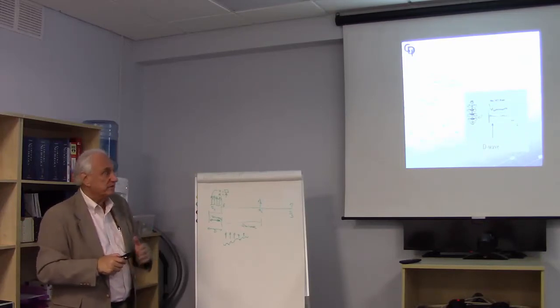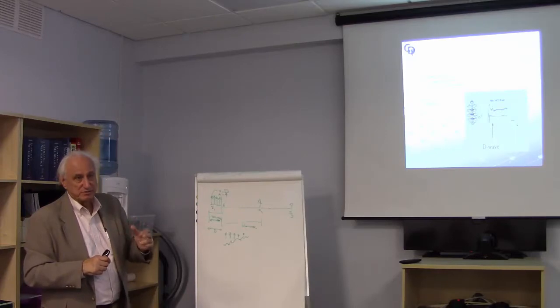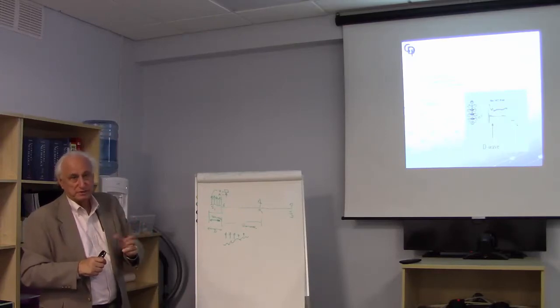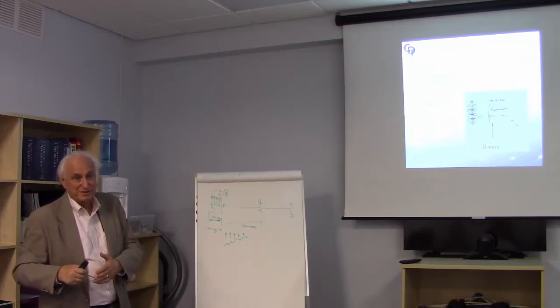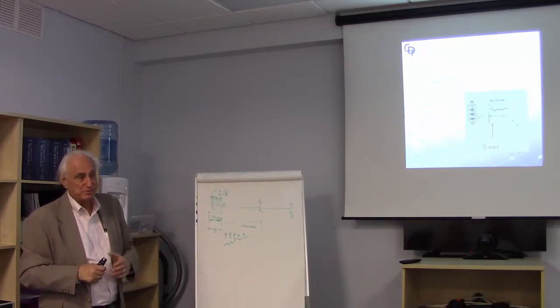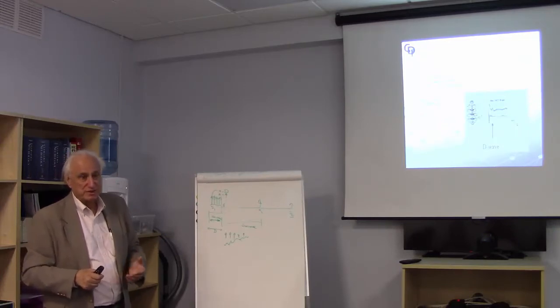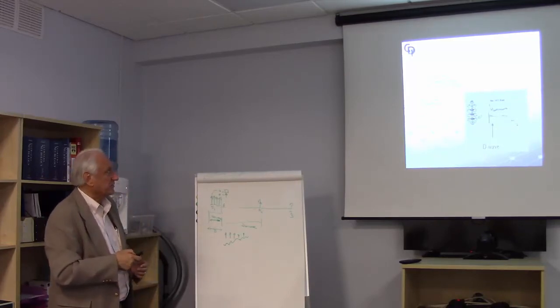get a response. So this is best a technique in intramedullary tumors that are in the upper thoracic or cervical area, or maybe mid-thoracic. But if you've got something that's down in the L1 level, don't expect to try to do D waves, or if you're at T10, don't expect to try to do D waves. It's not going to work for you. So that's worth thinking about.